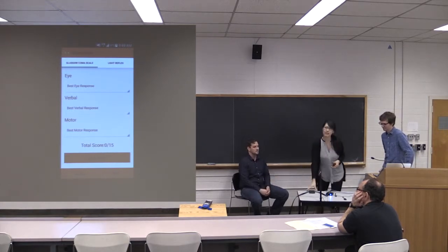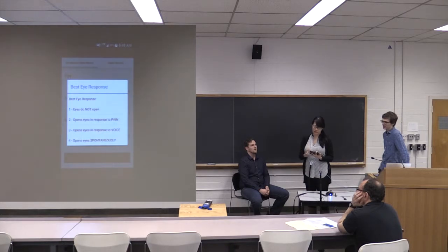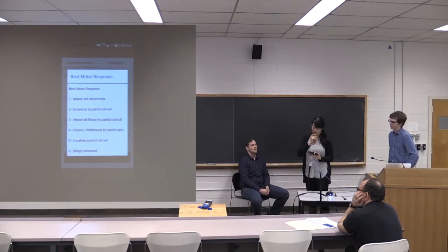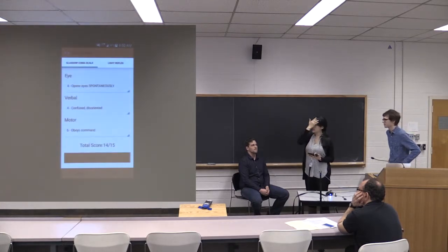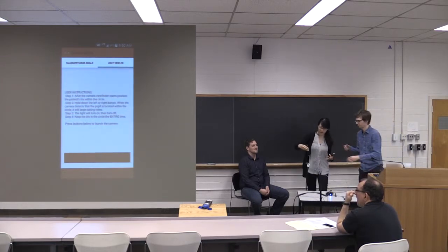Perfect. Okay, so through that interaction, pretty quick, I can input some data. I'm going to go through the quick input because it moves through every screen for me. For best eye response, Sean's eyes were opening spontaneously, so he gets scored a 4. Best verbal, he was confused and disoriented, scored a 4, and then best motor, he was obeying commands well, so 6. It tallies it for me, and it will keep track of this so I can track over time. So he got a score of 14 out of 15, which is within normal range. And then Clyde will move through the next part.